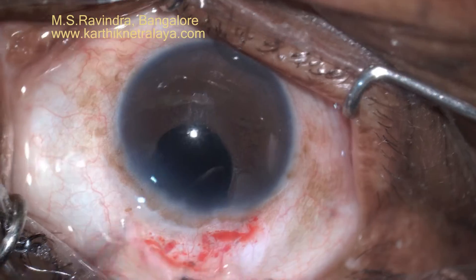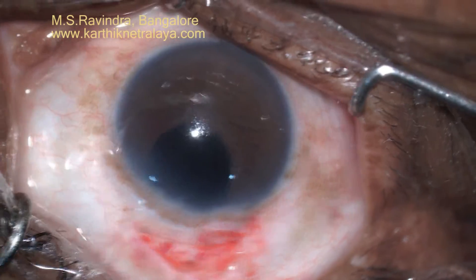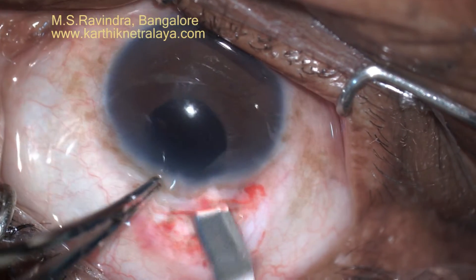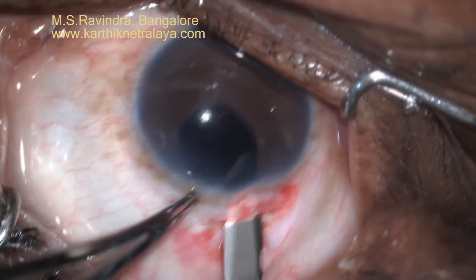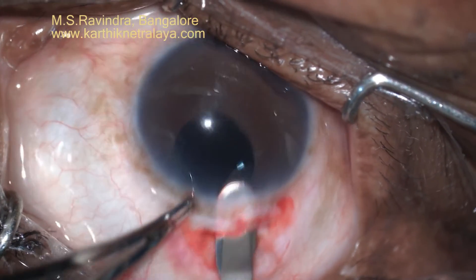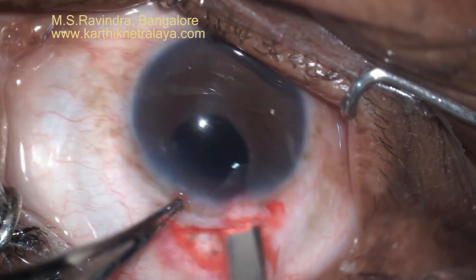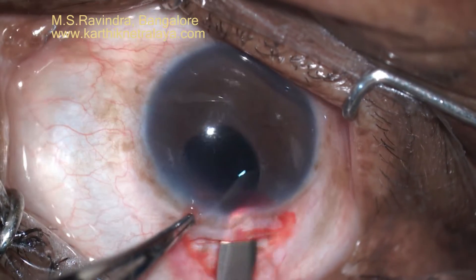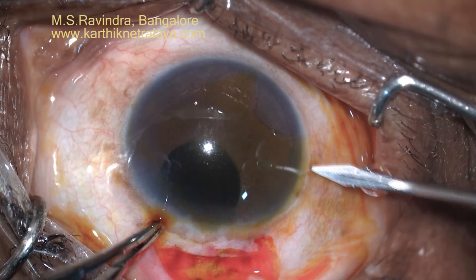Both pillars of the sector iridectomy were incarcerated into the tunnel. The patient had with-the-rule astigmatism with a steep axis vertically, so I decided to operate from the upper temporal quadrant. This will also facilitate enclavation of the iris claw lens behind the iris horizontally, where the maximal iris tissue is available.